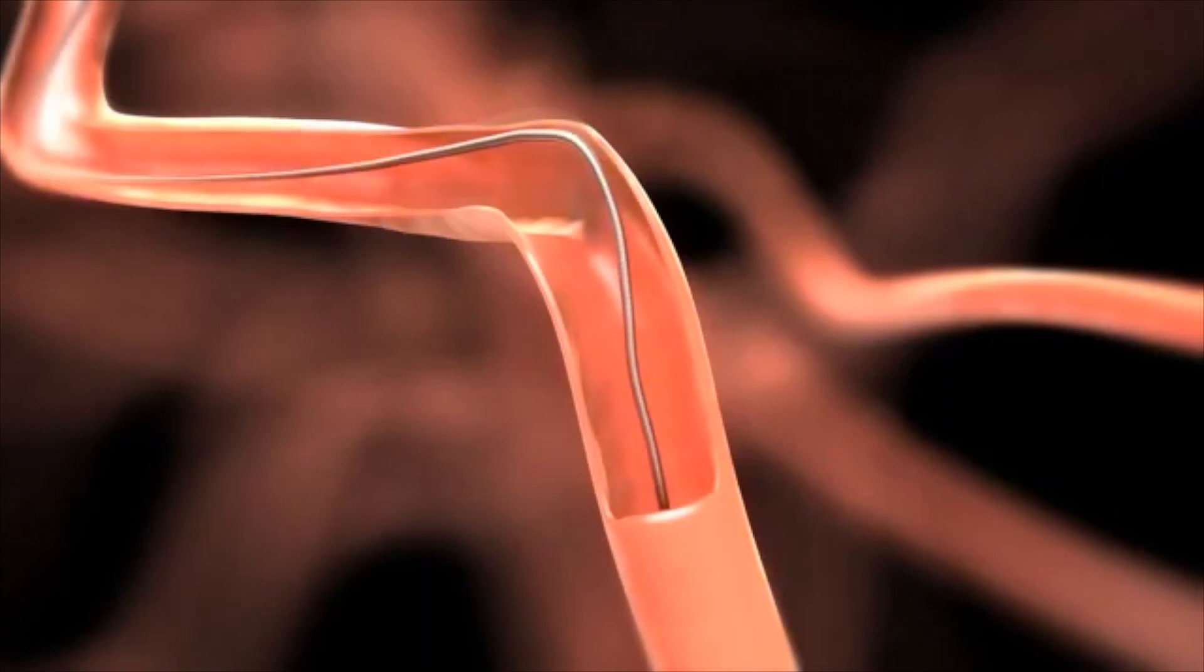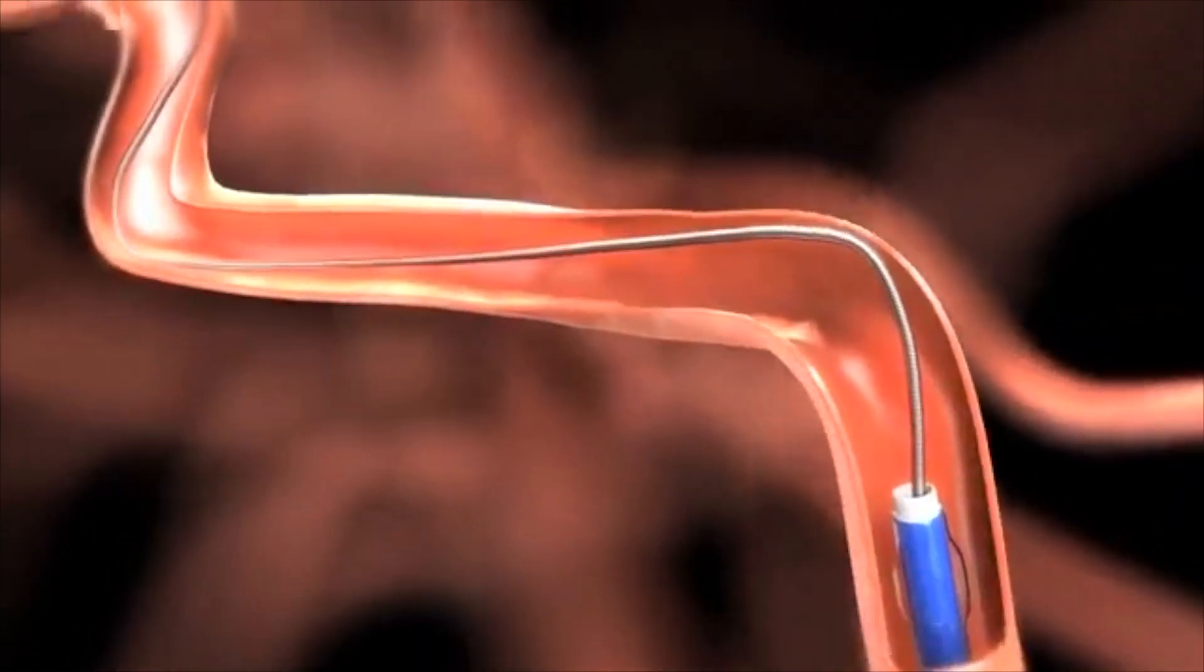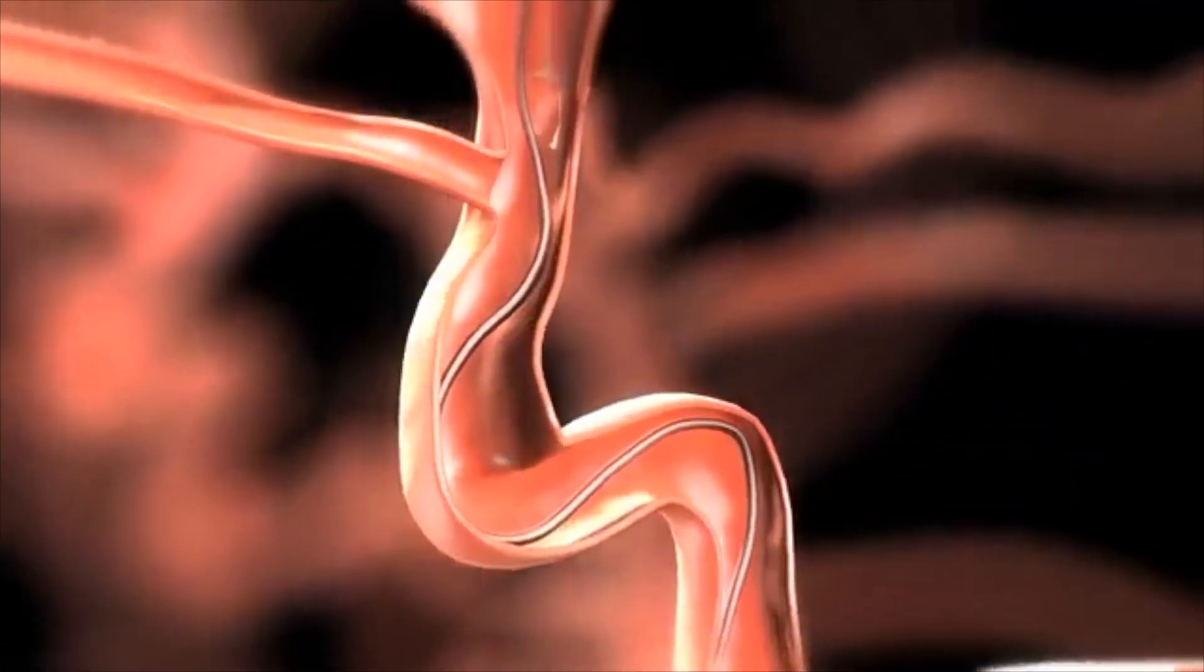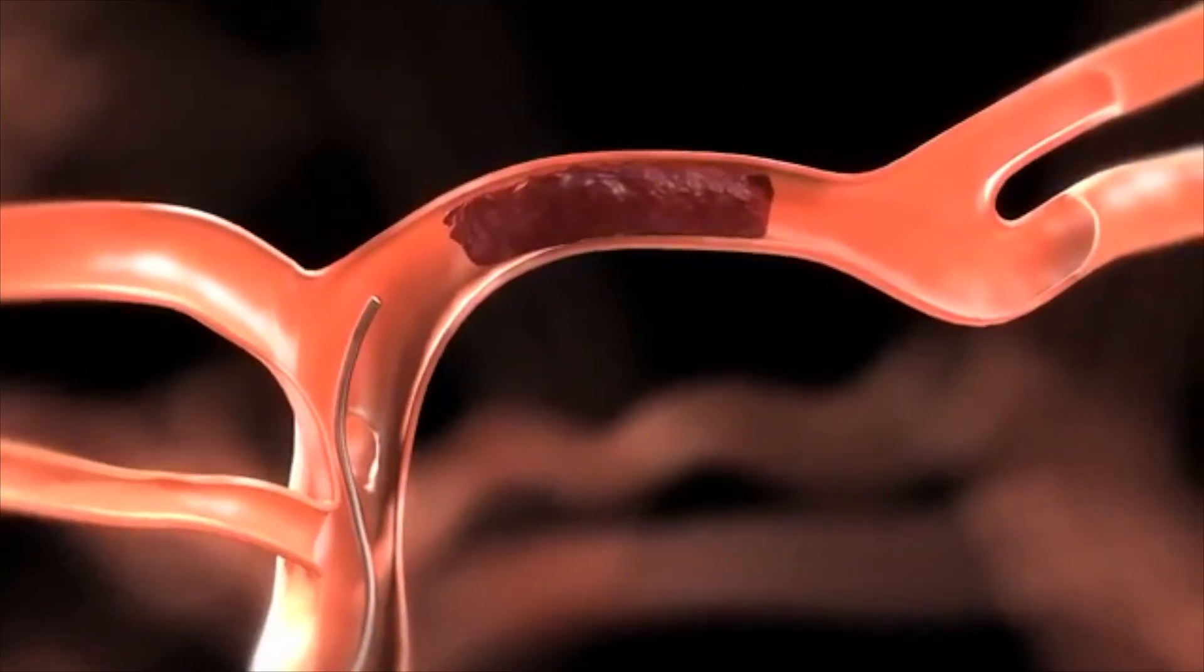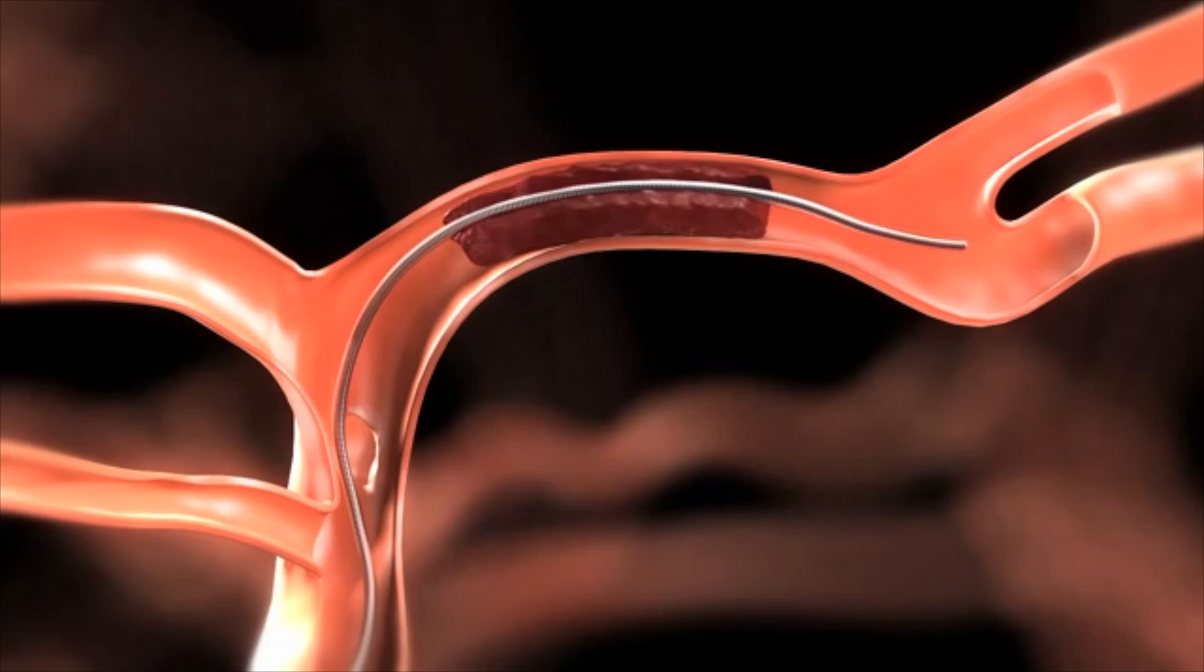Position the balloon guide catheter as close to the thrombus site as possible. Connect a rotating hemostatic valve (RHV) to the fitting of the guide catheter, and then connect the continuous flush.